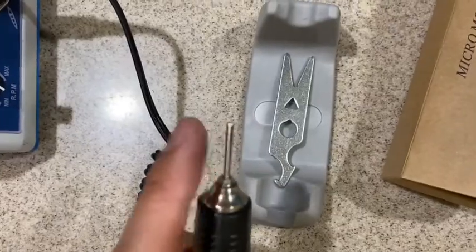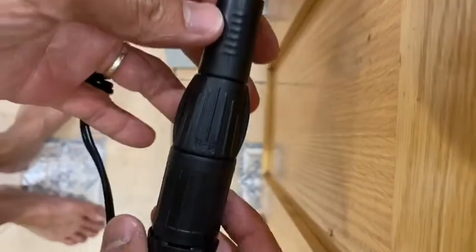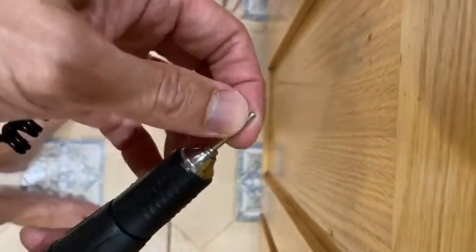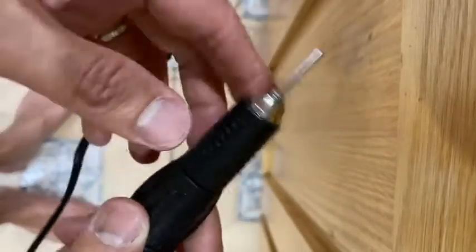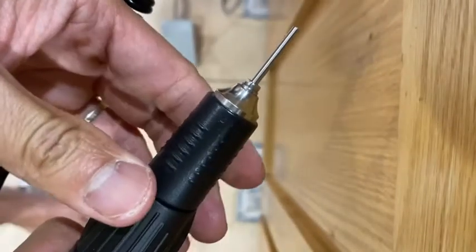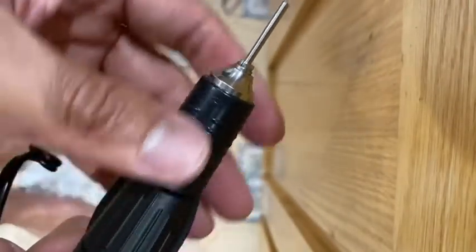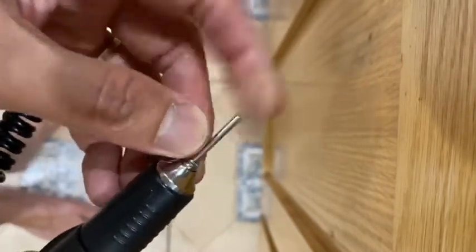Let me show you how to take it out. To remove the bur from the handpiece, you don't have to do anything with this point right here. All you have to do is just turn this right here — twist it — you hear a click, and you just release it. Very easy.